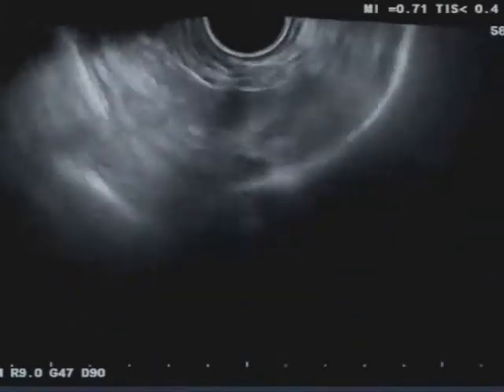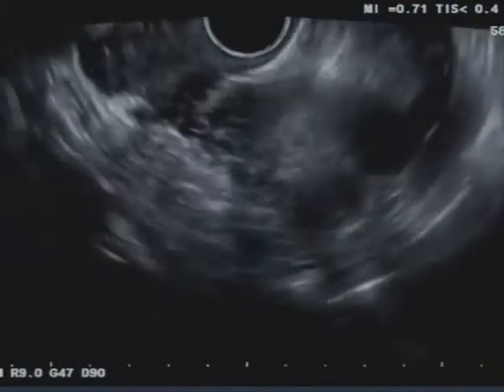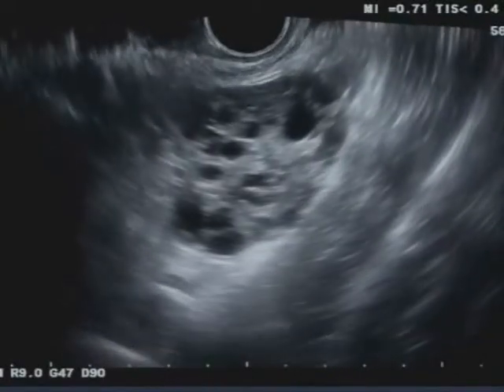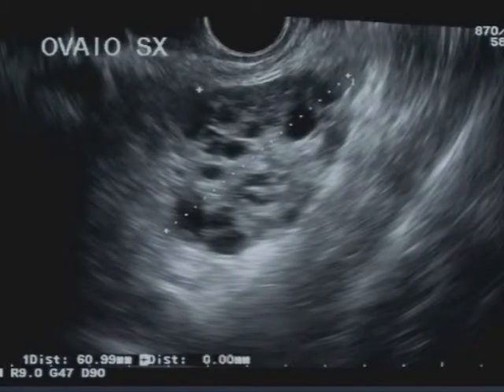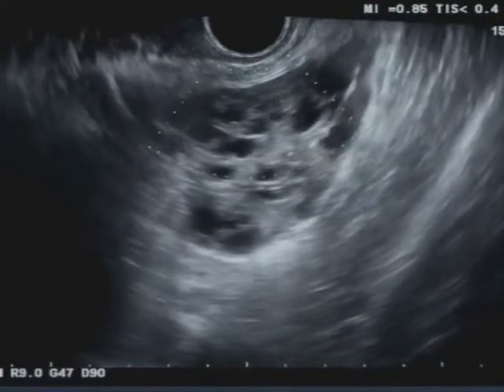Dear colleague, the case that I present today is pedunculated uterine angiofibroma. A patient over 52 years old, about 5 years in menopause, comes to our attention reporting pain in the left annexal region. It is necessary to specify that the mass you are looking at was labeled by us as the left ovary, and only during surgery will it be shown to be of uterine origin.